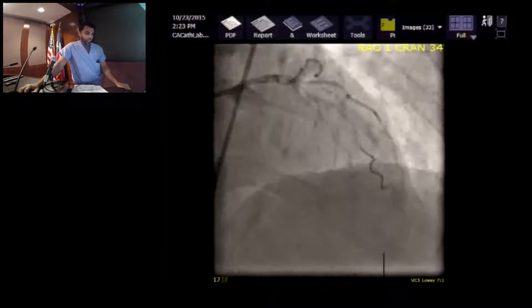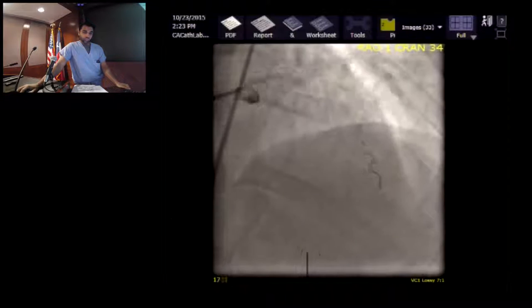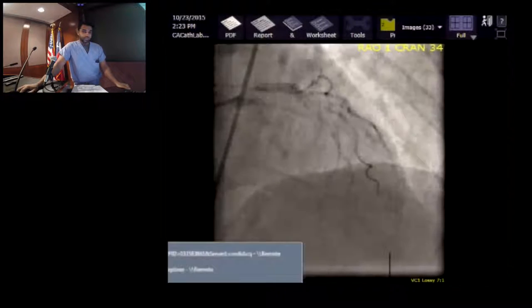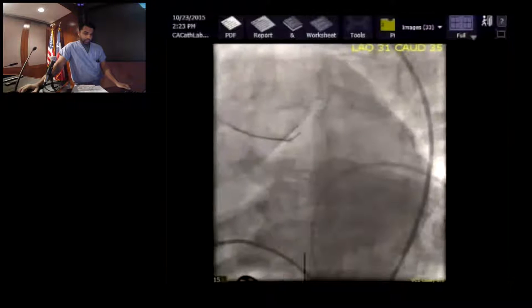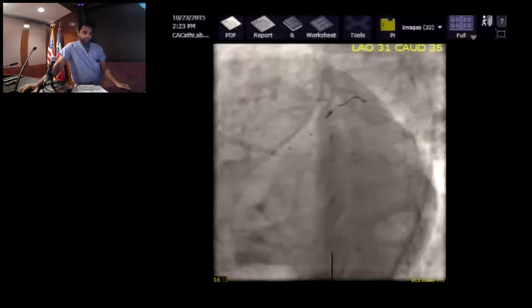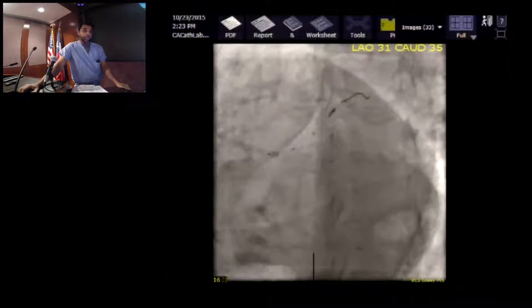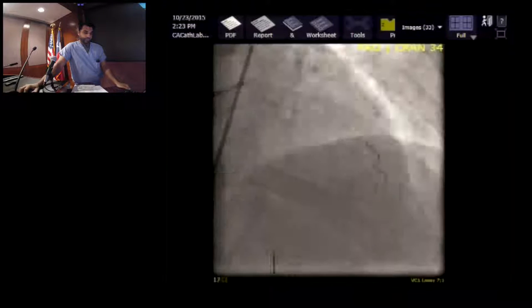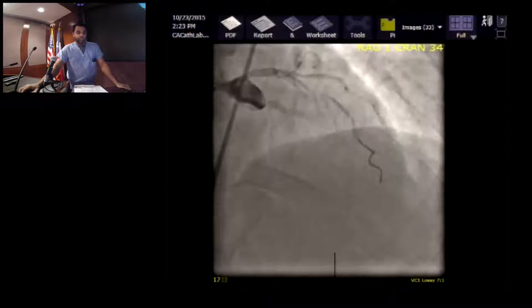So now the pressure transducer is not on a catheter tip, but within the wire itself. Can you show us a pressure wire? Sure, I just want to make sure everybody sees one. That's the pressure wire going in, or this might be an IVUS. Go back a couple of frames. There you go. It just looks like a regular coronary wire. There's nothing fancy about it.